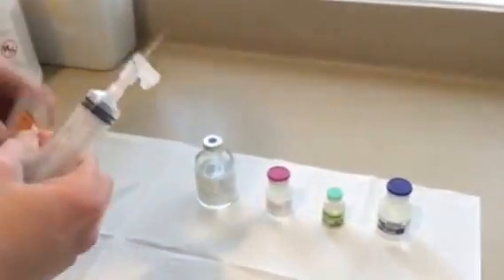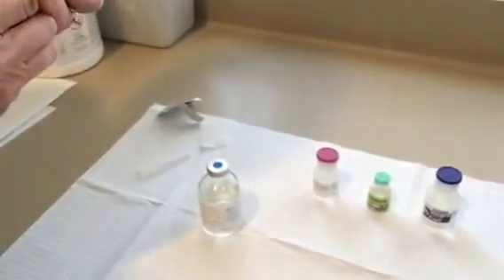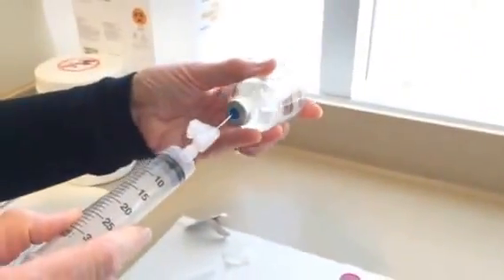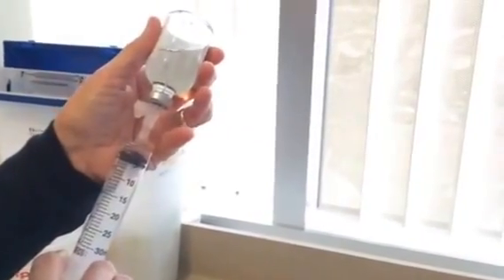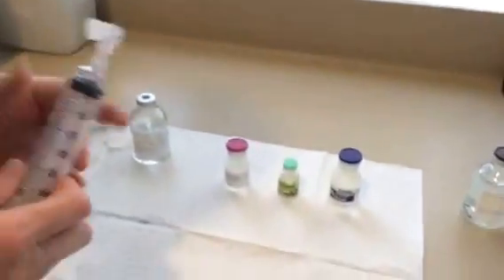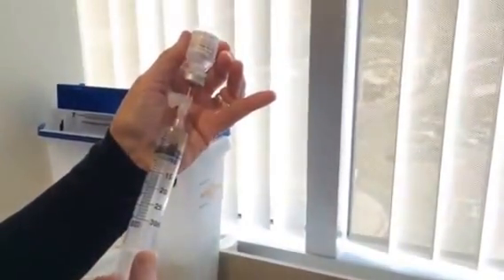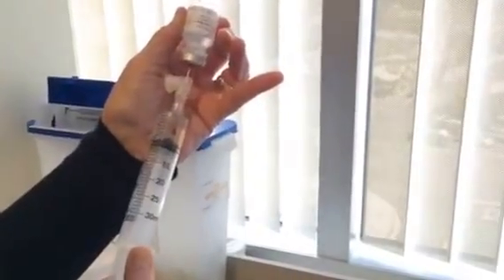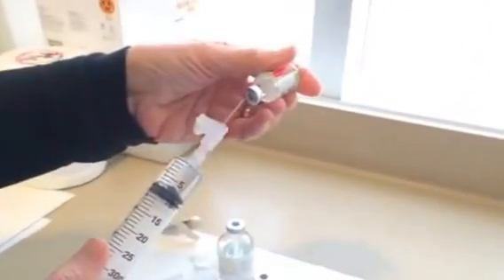To mix it up, we usually start with the sodium bicarbonate solution — 3 cc's of 8.4% sodium bicarbonate. We then put in approximately 5 cc's of sterile water, followed by 40,000 units of heparin.